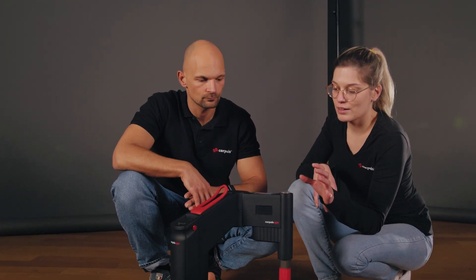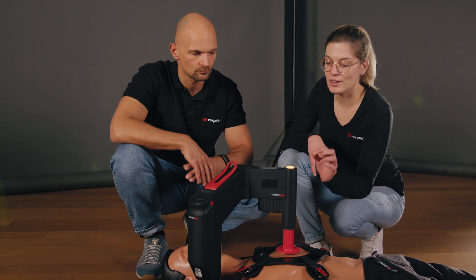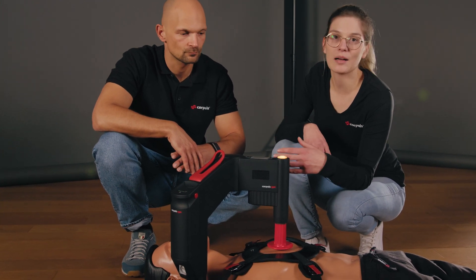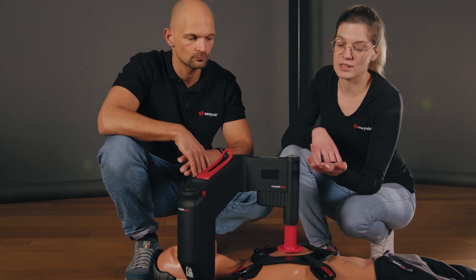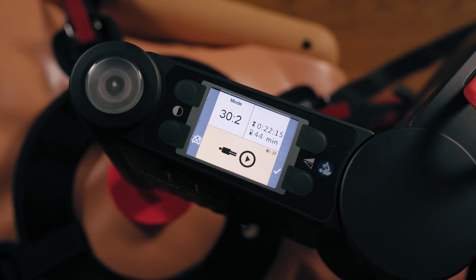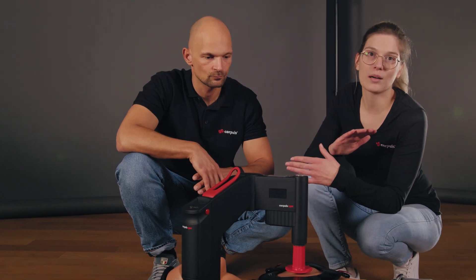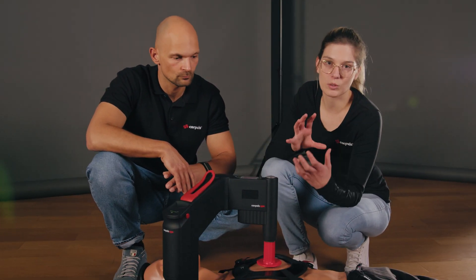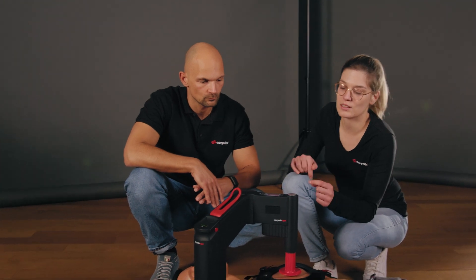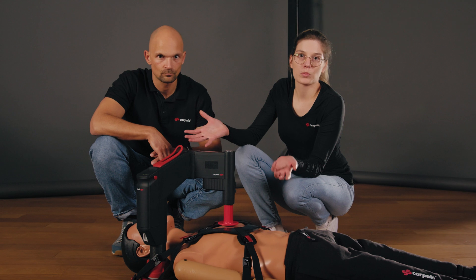Another possible alarm occurs when the therapy is interrupted. If therapy is stopped while running, the device alerts with a yellow alarm indicating you should continue. If nothing is done, the red alarm goes off after eight seconds, alerting that therapy has been interrupted for too long and must be continued immediately.